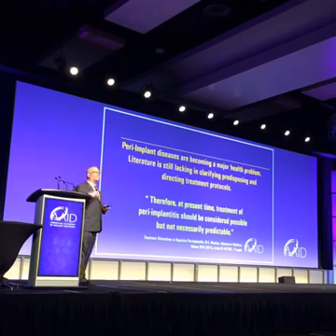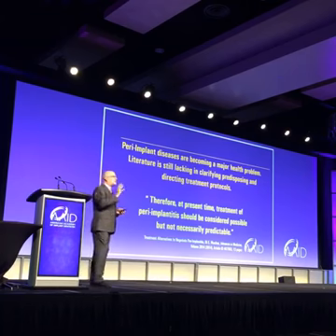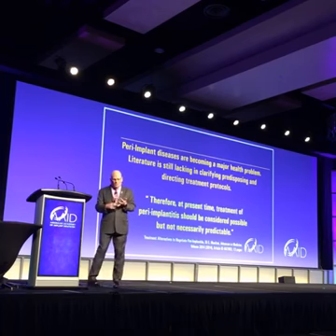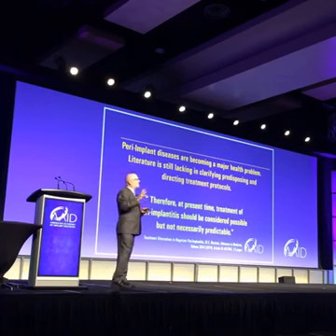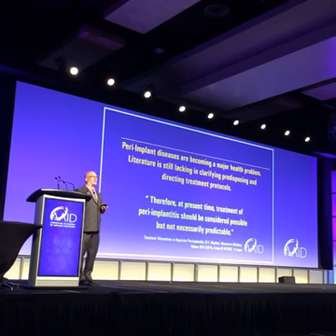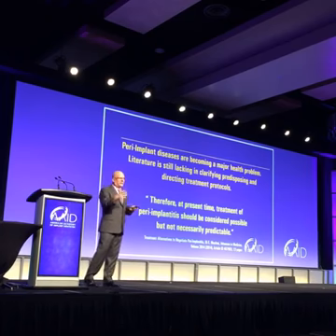The literature, however, is lacking in what the predisposing factors are and what directs treatment. How do you direct your treatment protocols? I was at the AAP and I went to the corporate forum. I went to 2 lectures on peri-implantitis. One doctor said lasers aren't any better for decontaminating implant surfaces, and they actually found a cotton pledget with water was actually a little better for decontaminating an implant surface than an erbium laser.